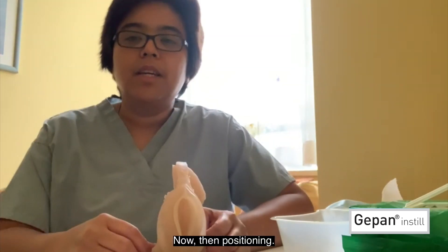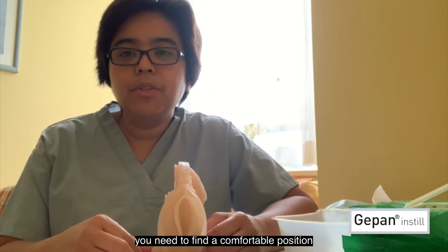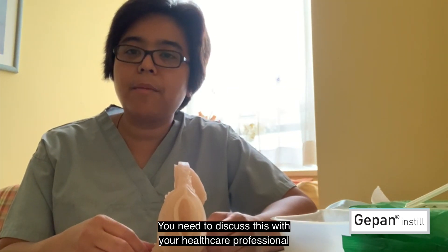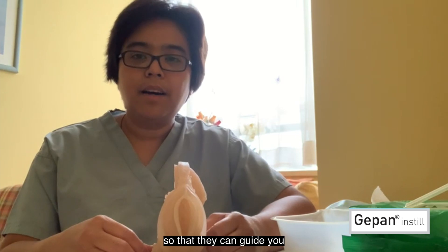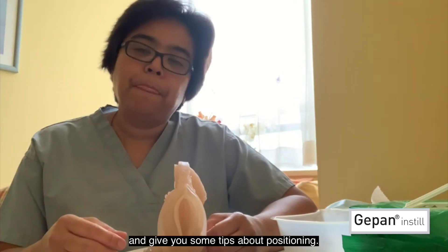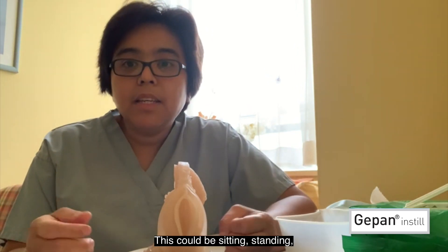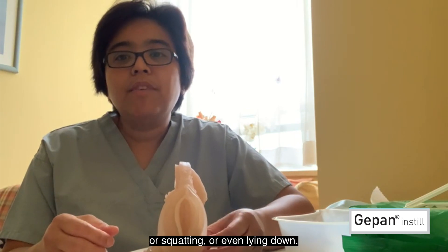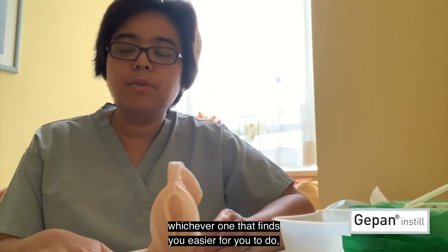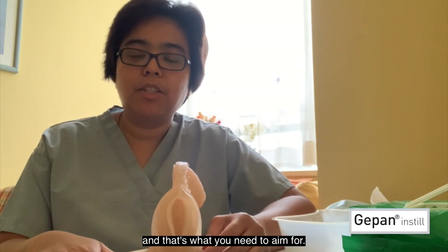Now, positioning. You need to find a comfortable position, whichever one suits you best. You need to discuss this with your healthcare professional so that they can guide you and give you some tips about positioning. This could be sitting, standing, squatting, or even lying down — depending on your circumstances, whichever one is easier for you to do is what you need to aim for.